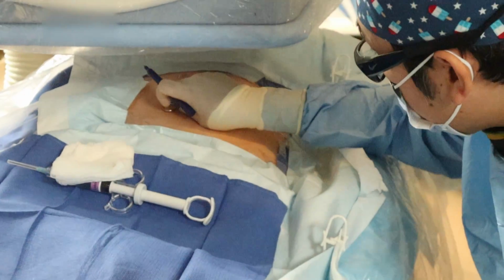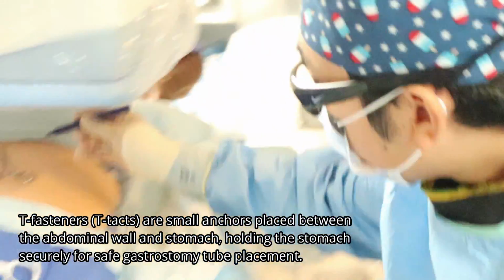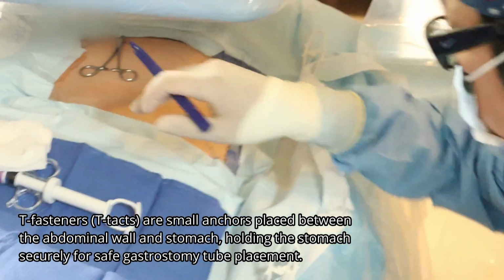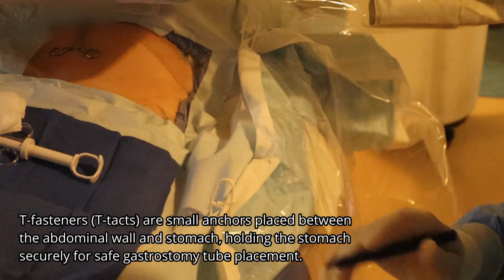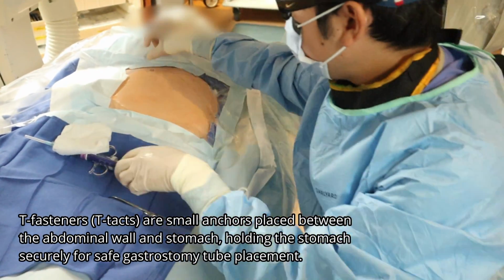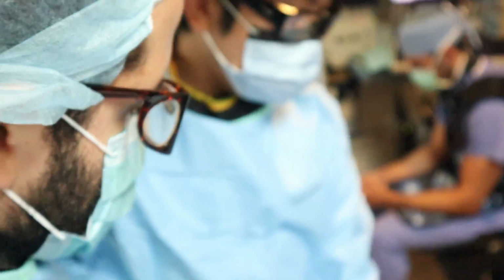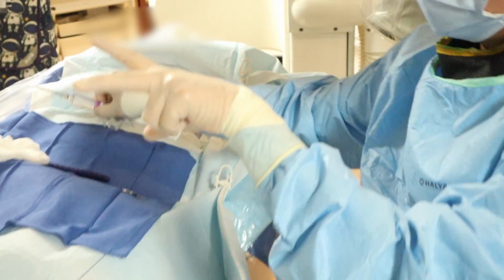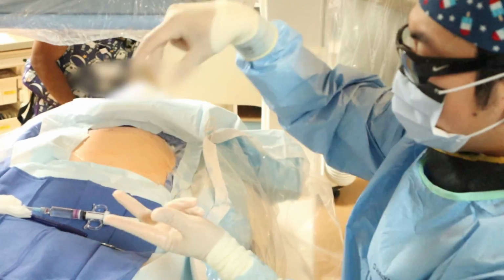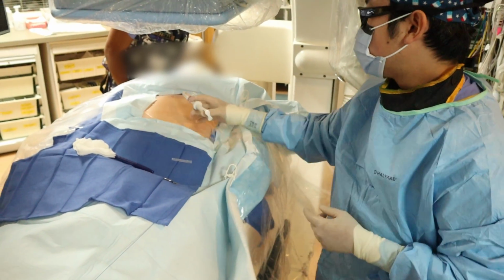We need the 3 T-tacks about a centimeter apart from each other. We want that to be a nice tripod to support this gastropexy. So ideally we should do our best to deploy 3 T-tacks every time. Sometimes people use 2 T-tacks, but ideally we want that nice tripod rather than a linear line to anchor the stomach wall to the abdominal wall. So now we've identified the site and drew markings here.